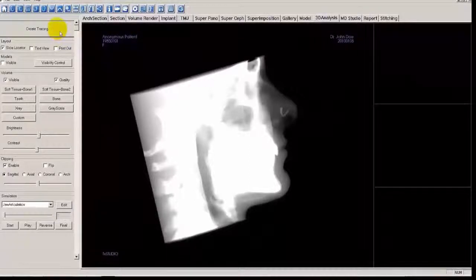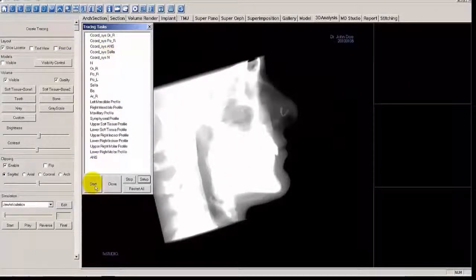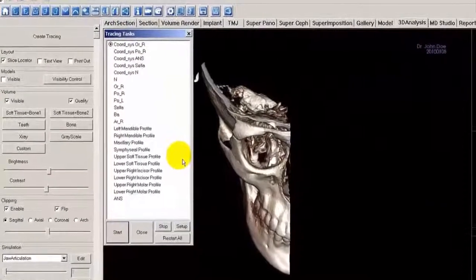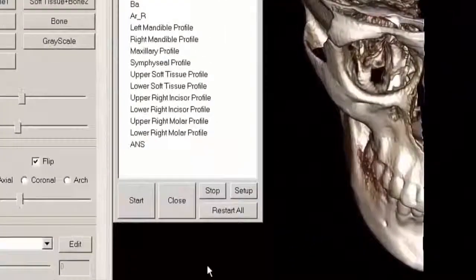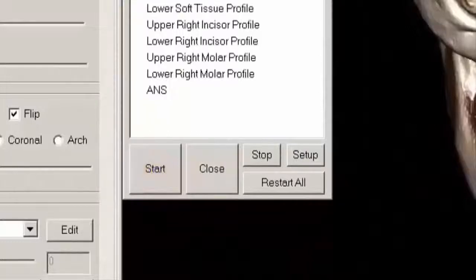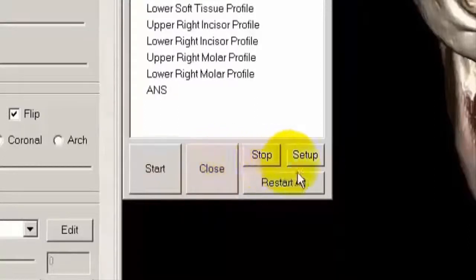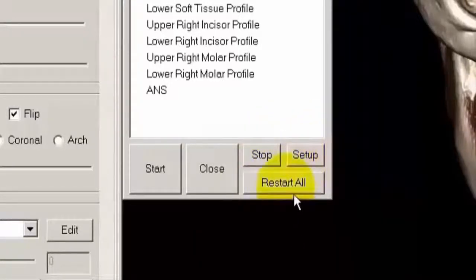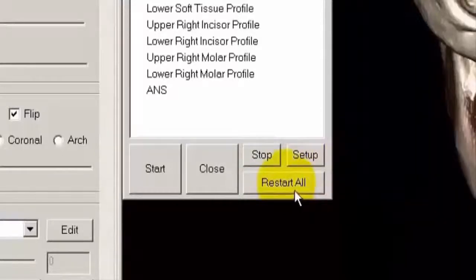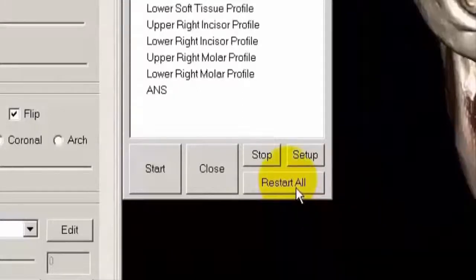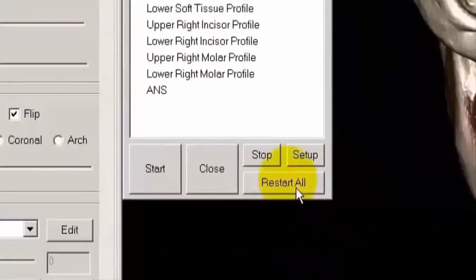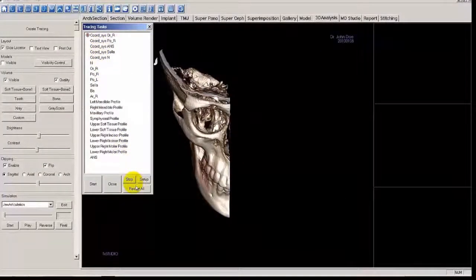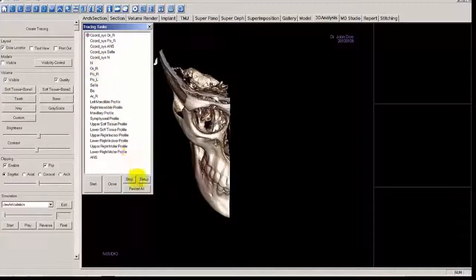Select Create Tracing again. Click Start to begin the tracing process. Before we begin, let's look at the functions at the bottom of the tracing task window. Start begins the tracing task process. Close stops the current tracing task and closes the window. Stop returns to the editing mode. Setup opens the tracing guide window. And Restart All completely discards the tracing task and restarts from the first tracing task — useful if you want to redo the entire tracing process rather than individual landmarks.